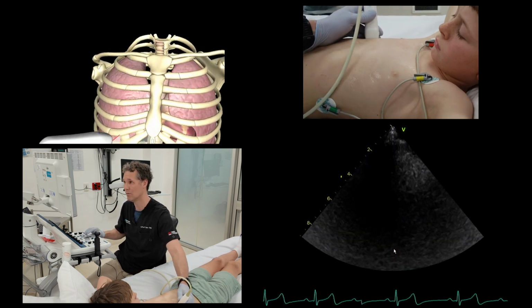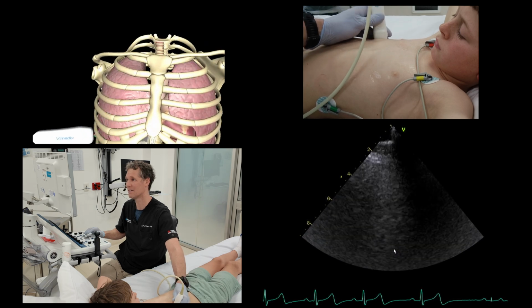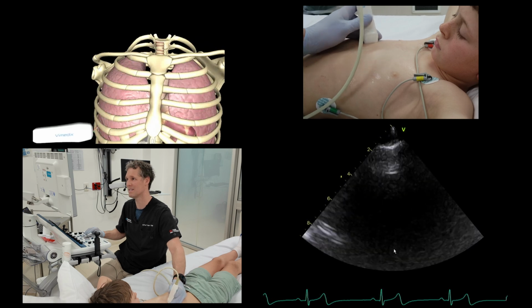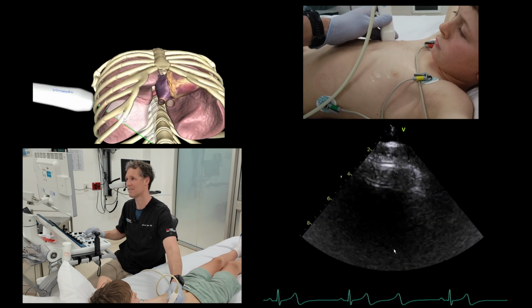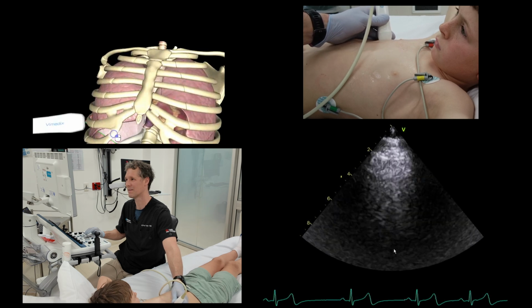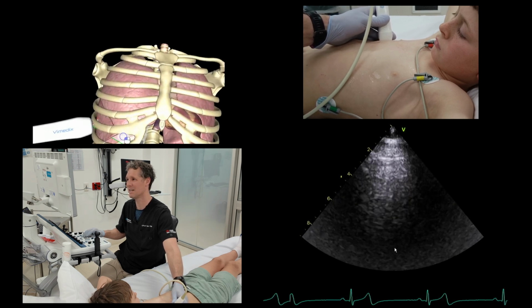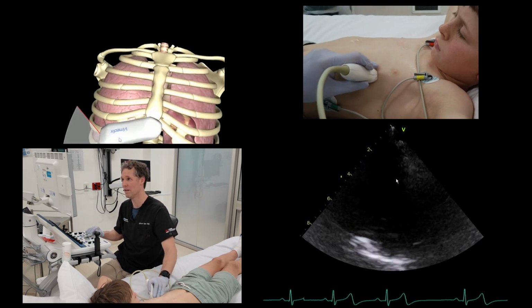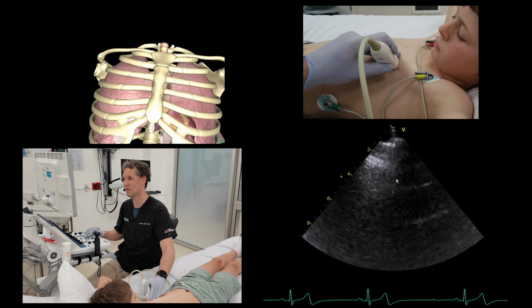I'll look on the right base, come up a little bit, just nestling into there. Nestling in, and there are the A lines again, coming all the way down, and I'll look at it on the left side as well.